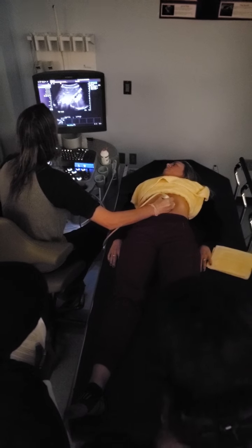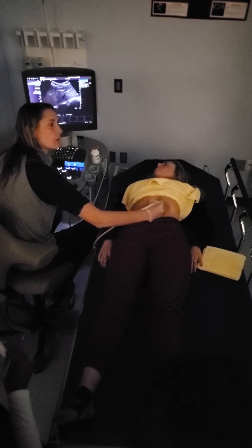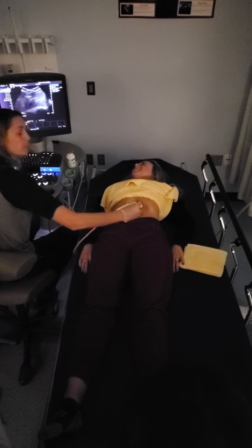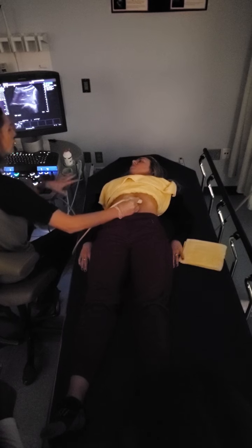So the border that's really important in here, go ahead and breathe, is going to be this lateral one. So how do I collect that lateral border? I move my probe towards that shoulder. Okay, when you're ready, big breath. Oh, and go ahead and breathe.